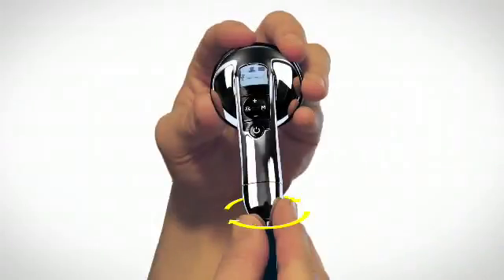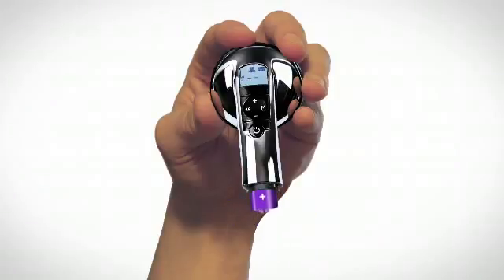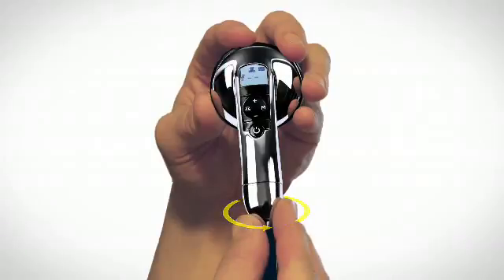Begin by slightly twisting the battery cap and, with the positive end out, insert a AA battery included in the product package. Remount the cap and twist it to lock into place.